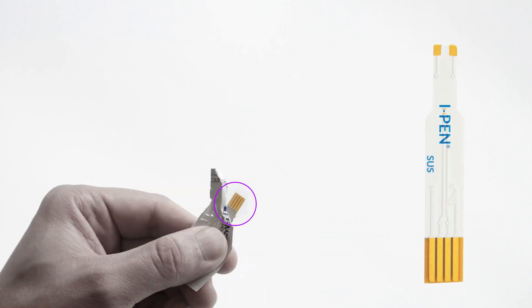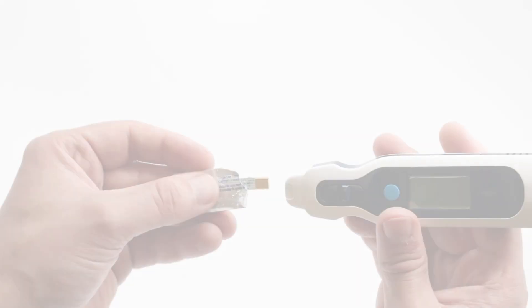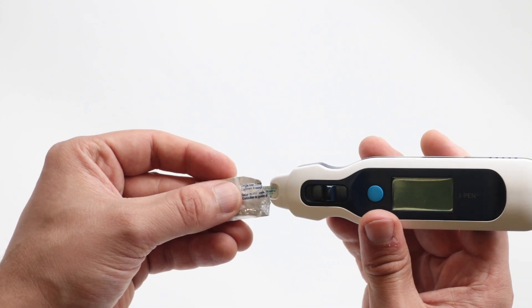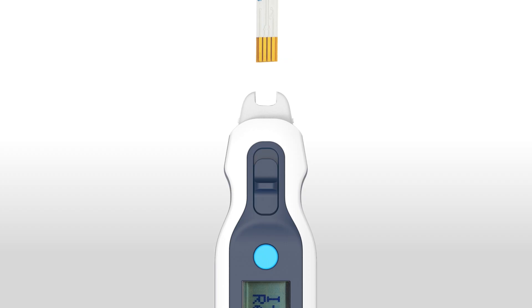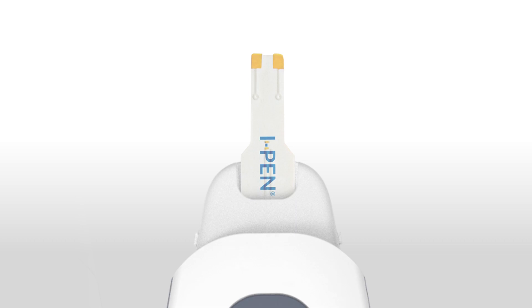Be careful not to touch the exposed gold electrodes on the tip of the sensor when inserting the sensor into the device. While holding the single-use sensor in its packaging, insert the exposed end of the sensor firmly into the opening of the eye pen. Take note to fully insert the sensor so that its shoulders line up correctly with the device. This ensures proper internal contact for all the electrodes.